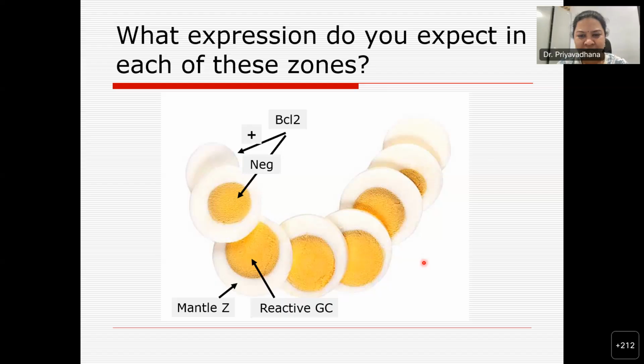And you do realize something that you should realize. This is the end of the follicle, right? When you have a spherical structure with a center, the center doesn't extend to the periphery. You must remember that. So if you have sliced it so that there is a peripheral area, what you are probably getting is just the mantle.